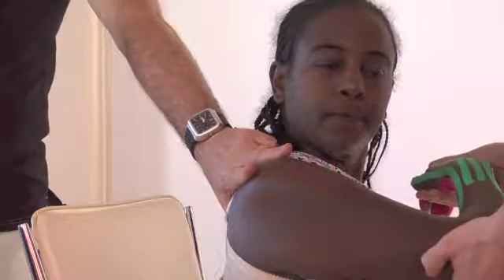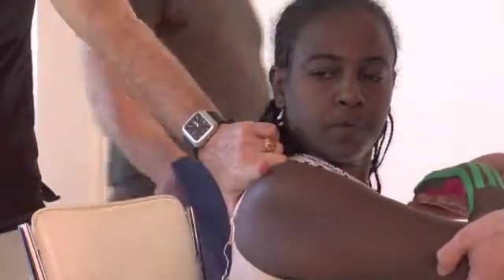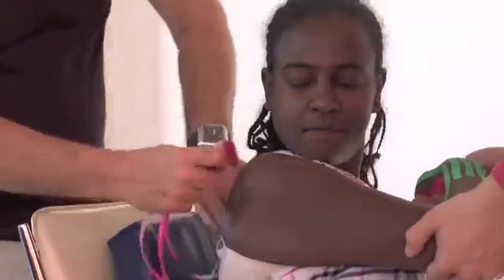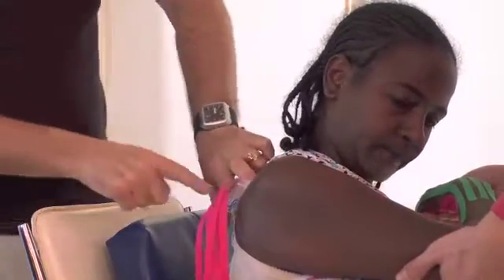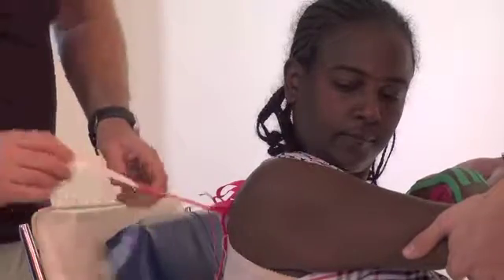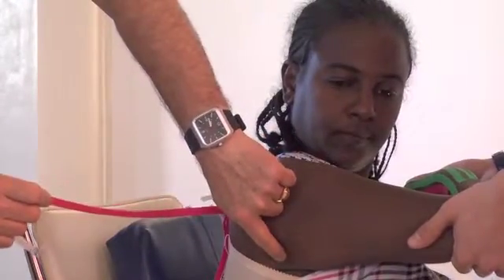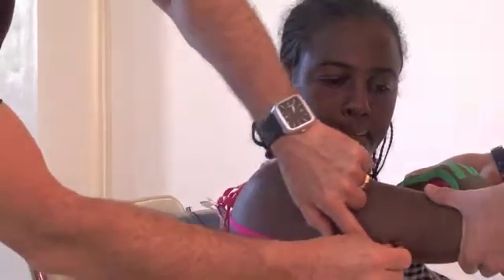You have to study this application because we are going to do this in a little while before lunch. Here we have the scapula. You have to apply the tape at the superior medial corner of the scapula. You are going to break the paper — you can break it manually or just cut like this. We get the first strip inferior, which means you are going to go down to the posterior armpit corner, and then straight along the triceps.